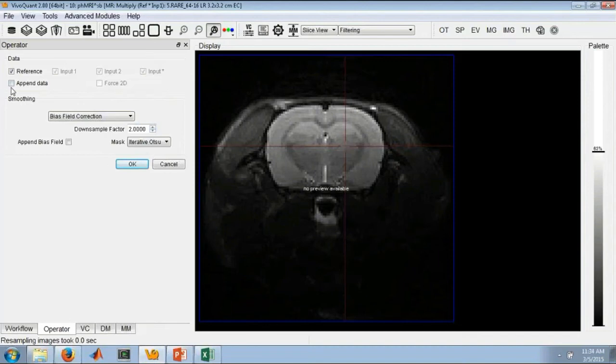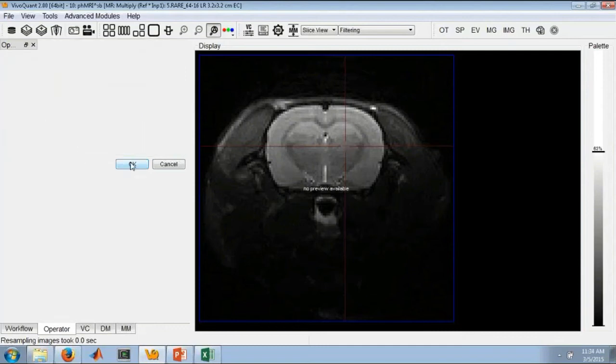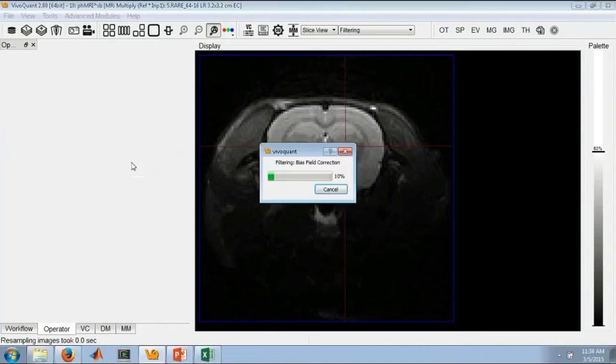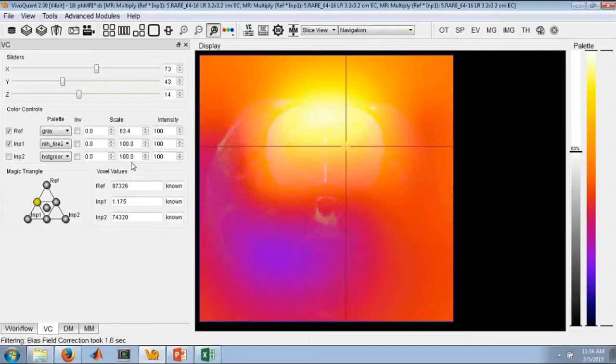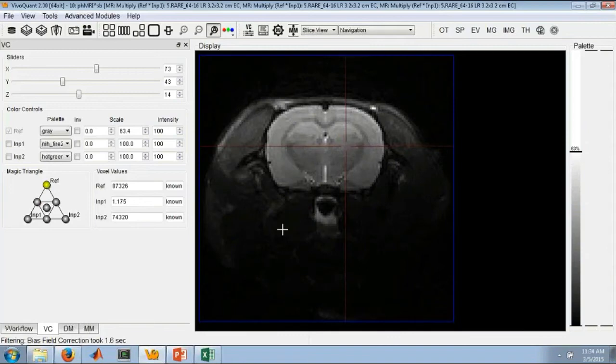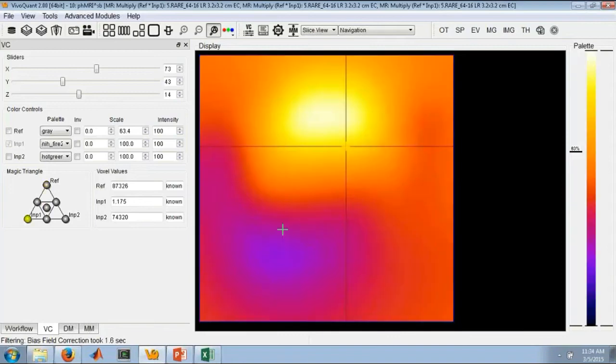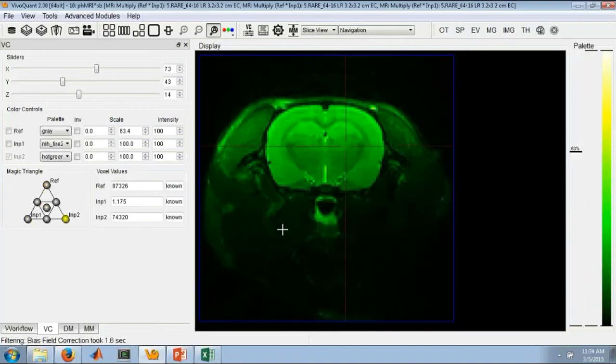We can also append the resulting data. If we don't select this, then the loaded data will simply be edited. And we can apply the bias field if we're interested in seeing what correction has been applied. So here you can see loaded right now we have the original data, the bias field, and then here's our new data set.